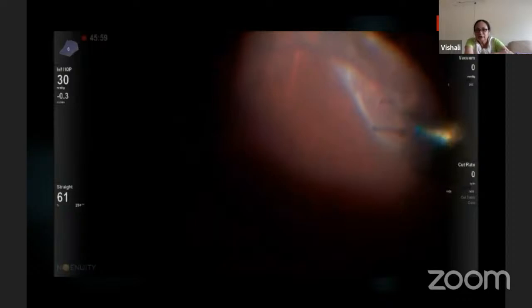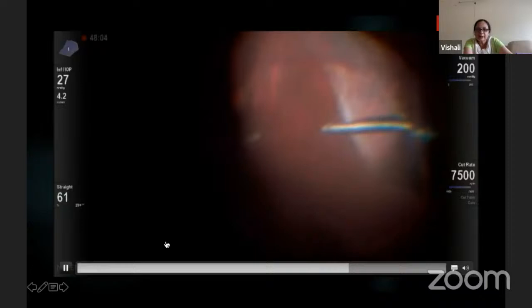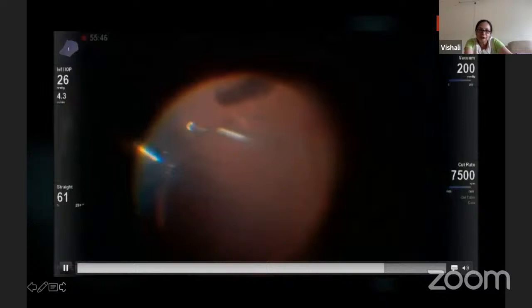So I do have the video. So it was just teased off, taken out into the vitreous. And you can see, then just cut it. There was no attempt made to remove it in total because there was no diagnostic dilemma, so no point in extending the sections and doing histopathology or anything. So that's the moral of the story, that sometimes we get caught up with the phenotype that the patient is presenting and we don't even pay attention.